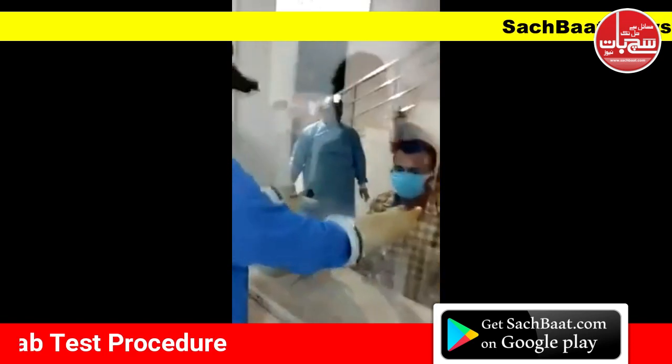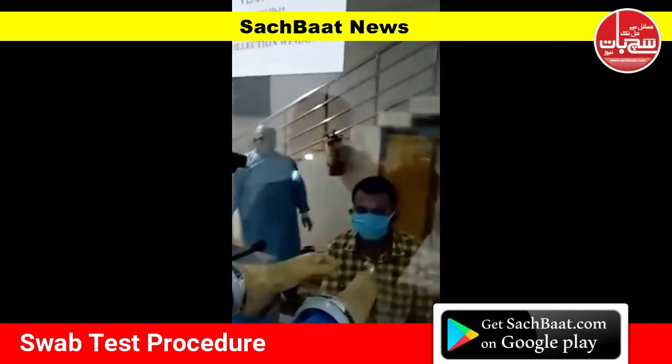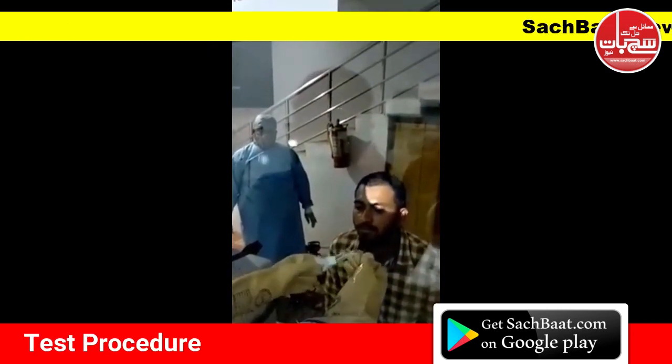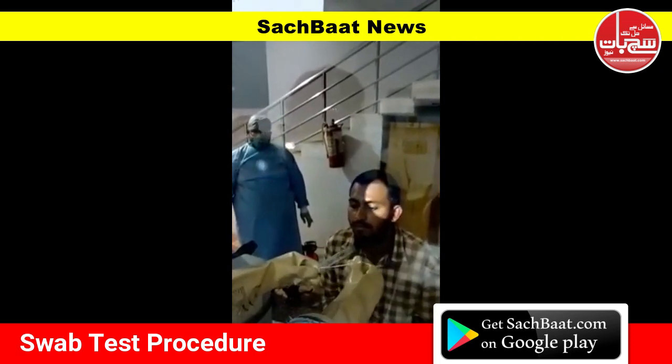The doctor is inserting the hands through the glass pane. He has taken the swab and is removing it, taking it out. That is the swab with which the sample is taken from the throat.